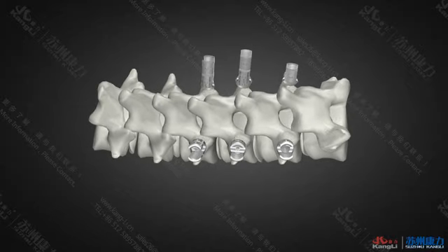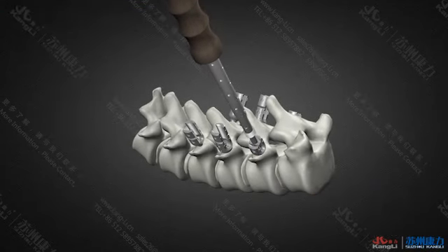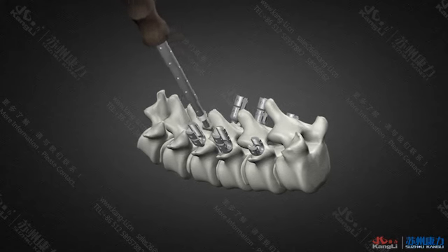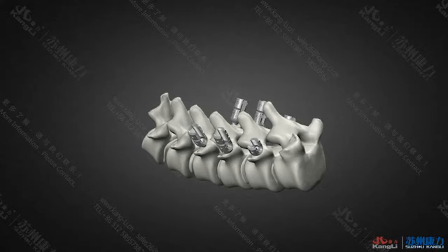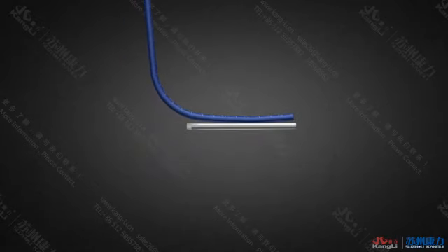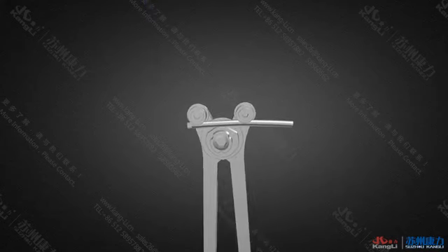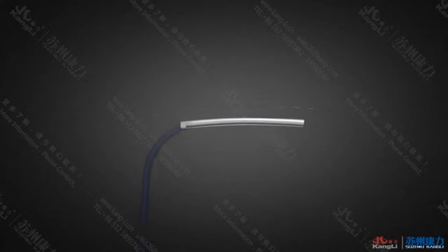Finish the implantation of other pedicle screws. Step 5. Implant the 6.0mm connecting rod. Use the fixing nail holder to adjust the screw head. Then use the pattern rod to determine the proper curve and length of the 6.0mm connecting rod according to the position of the screw. After that, bend the 6.0mm connecting rod of proper length with the rod bend clamp. Finally, use the rod hold clamp to install the connecting rod into the cart slot of the U-type pedicle screw. Attention! The black label of the connection rod should be vertical.